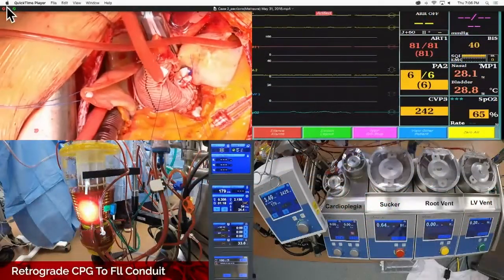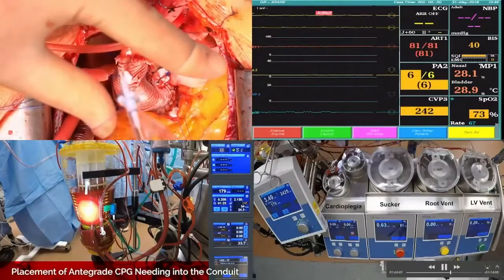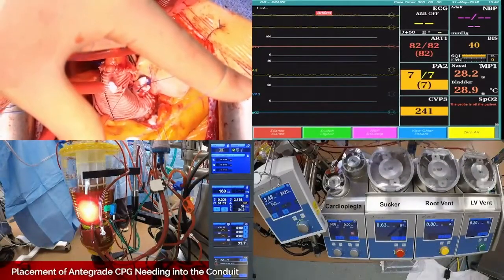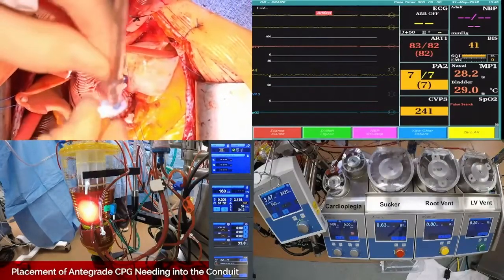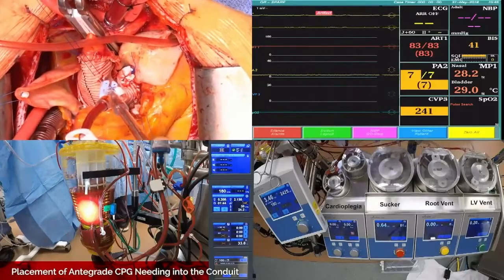I'm not a huge fan of it because the edges fray. If you really look closely, I've everted the edges proximally. Right, sure, I can kind of see it. I know what you're talking about, folded back on itself. Right here. And so you get a double wall of the graft itself sewn to the aorta, it typically leaks less. The edges fray a whole lot. If you do bypass grafts off of it, you'll typically use an ophthalmic burner, like you would if you're tying a nylon rope. You cut it, you burn it with a lighter at the end, so it keeps it from unraveling.